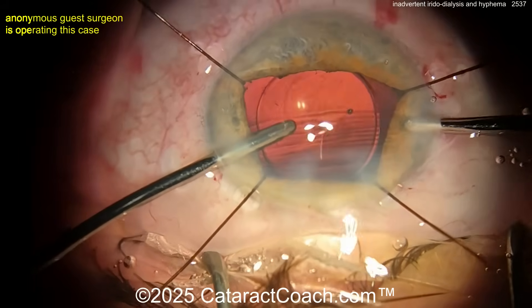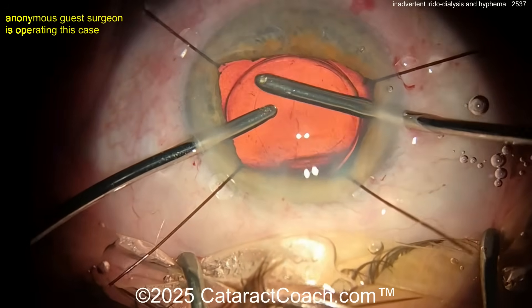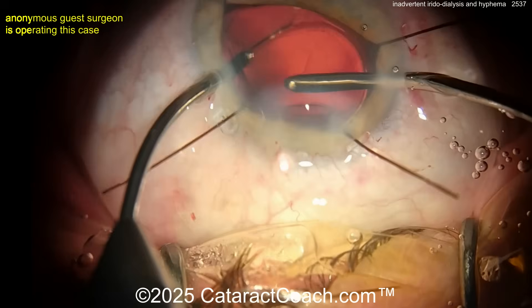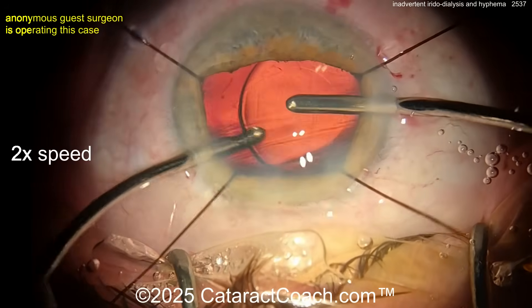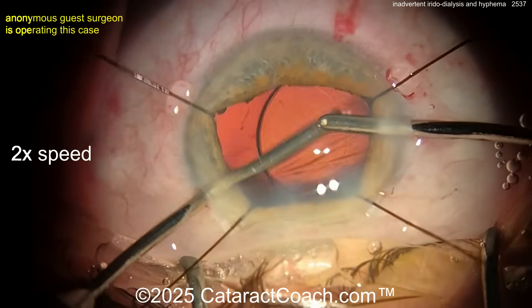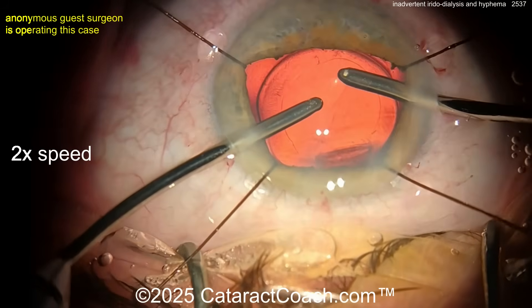Remember, not just a shallow AC, but the iris hooks tent the iris up a little bit. So when you go in at the paracentesis, if you're not careful — as you just saw — you can inadvertently snag that edge of the iris. By pushing it in, you cause some iridodialysis.